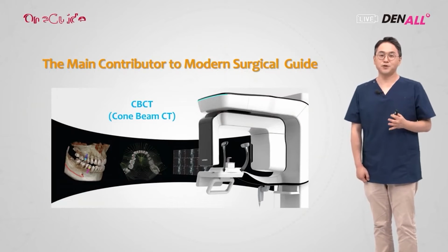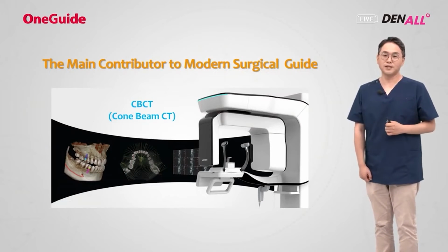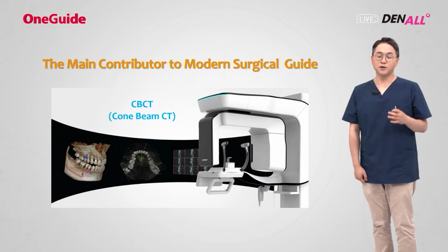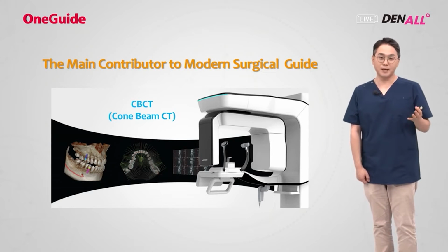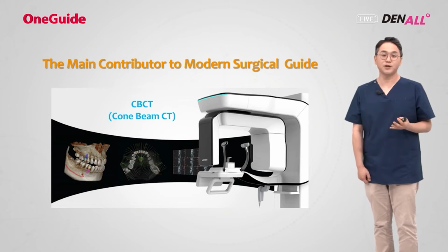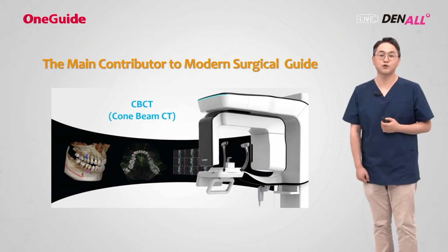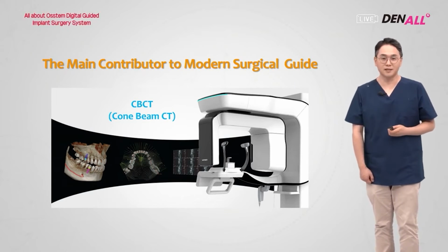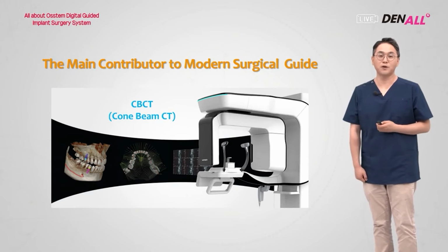Digital guide surgery has become popular because of CBCT. Cone beam CT is widely used, and you can see teeth, bone, anatomic structures, mandibular canal, sinus floor. You get accurate information of anatomical structure. And this has made guide surgery possible. Without CT, digital guide surgery might have been difficult.